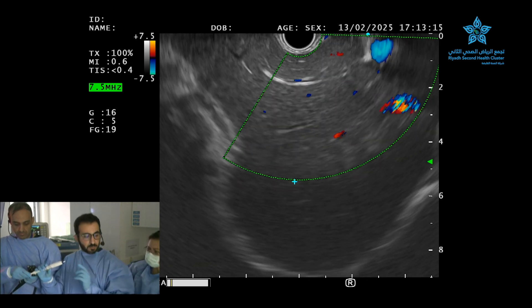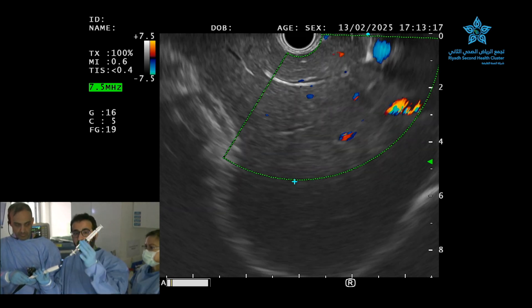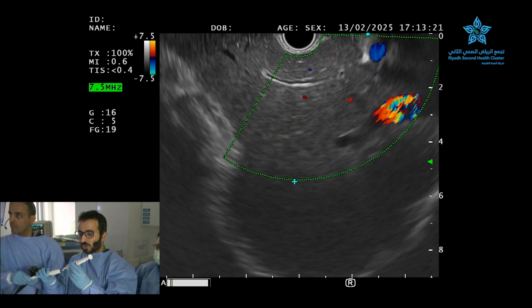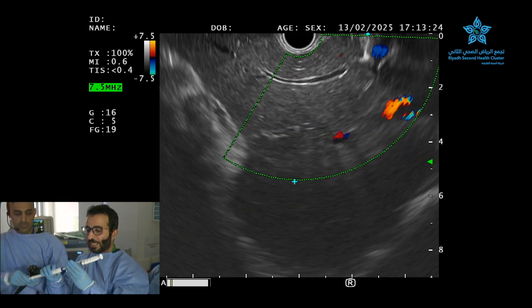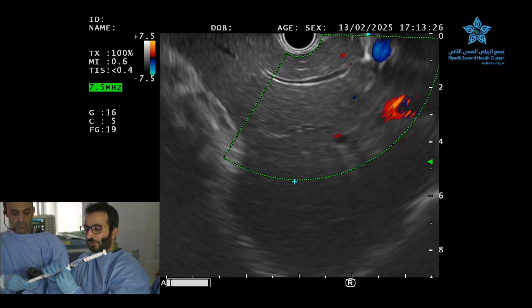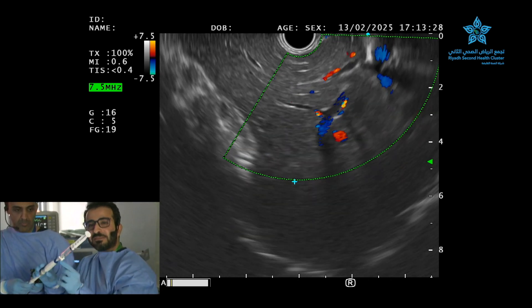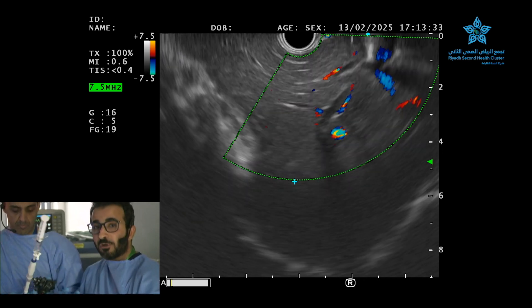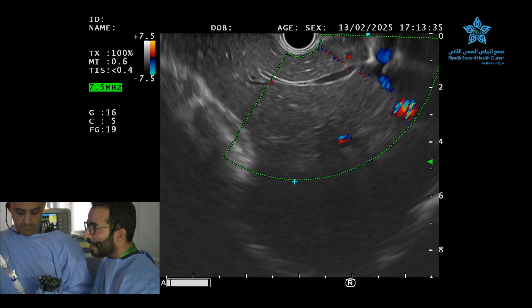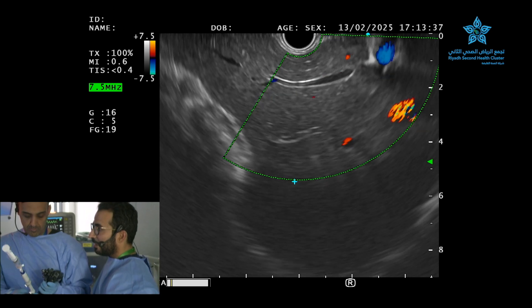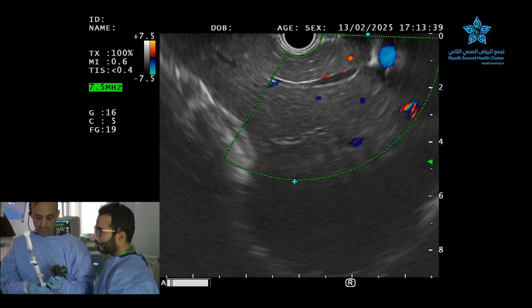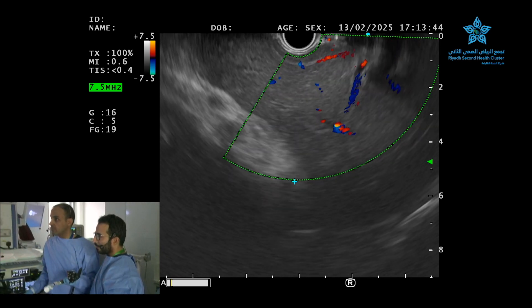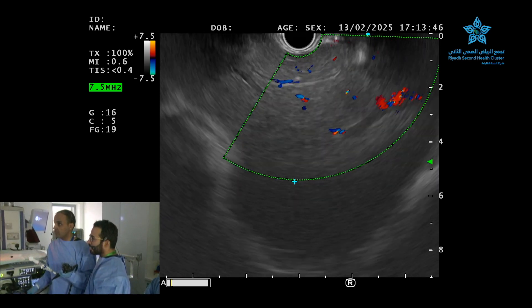We are going to attach a negative pressure syringe that has two cc of heparin. We will use it for the wet heparin suction technique. We connect it now and always keep it locked — we don't unlock before the needle is inside the liver, to avoid contamination. Nawaf is preparing the needle in position. Very nice demonstration, Dr. Adil. We will give you three minutes and then switch to the fluoroscopy room.